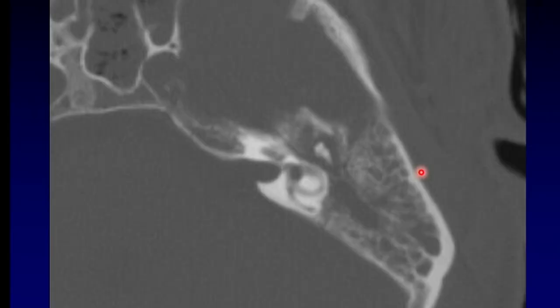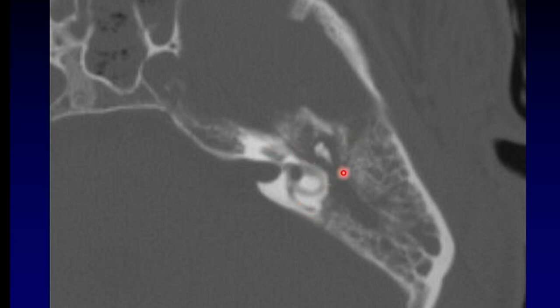Sometimes we are left with an oblique fracture. You might think this is a transverse, but it doesn't quite hit the inner ear because it runs right behind it. This is why that new terminology of otic capsule sparing and otic capsule violating is so useful. Although this has a transverse orientation, it is otic capsule sparing.